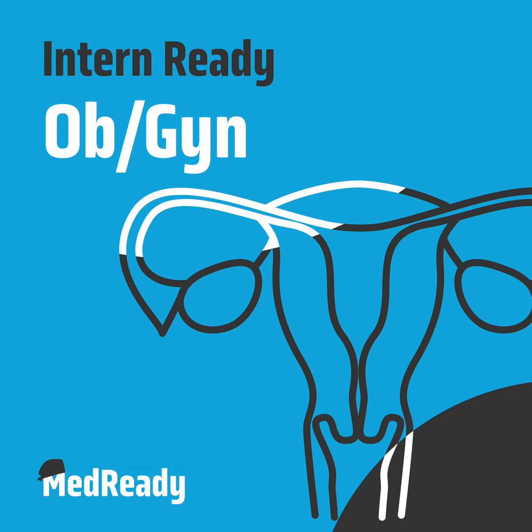You'll hear your attendings talk a lot about the fluid deficit. That was always really confusing to me as an intern, to even know what that really meant. So what that means is when you are placing fluid into the uterus, obviously you would hope that all of the fluid comes back out, because you don't really want it to sit in the uterus, because then it can move out through the fallopian tubes and start to sit in the belly. Like extravasate, essentially. Yes, exactly.